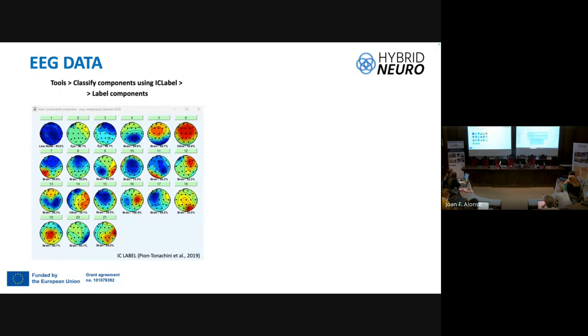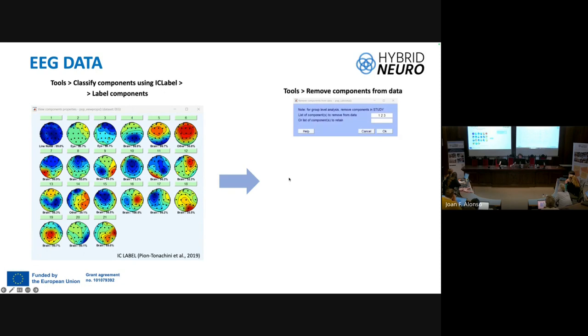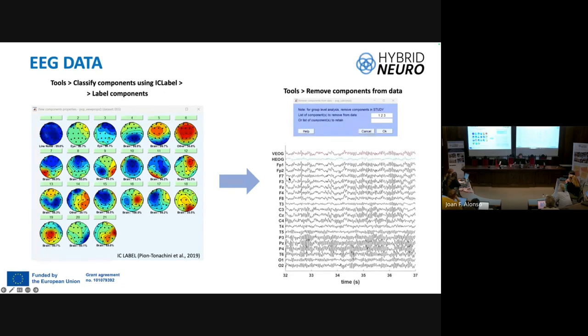We accept, for example, and this is another data set, as we had before for the notch filter. In this case, we can put a name, EEG SOBI filter. Now we can plot our data, and we can see that it's free from the power line and also from the EOG artifacts.